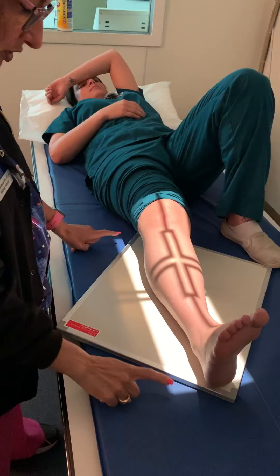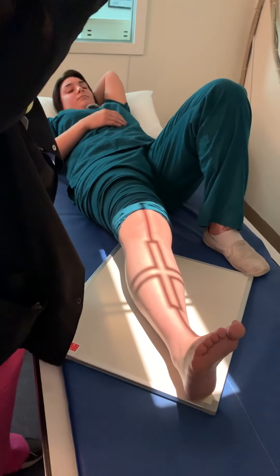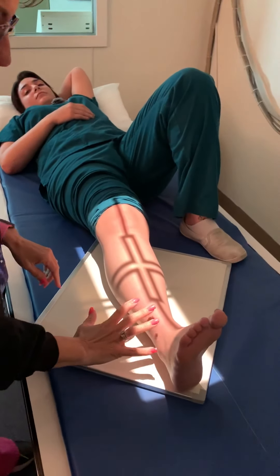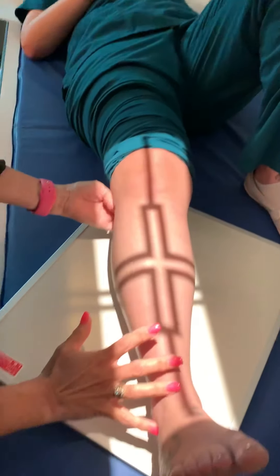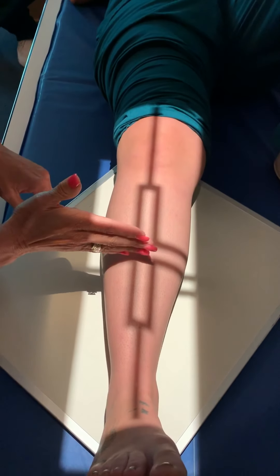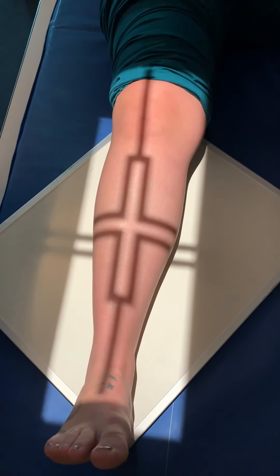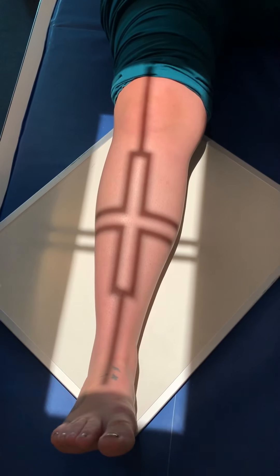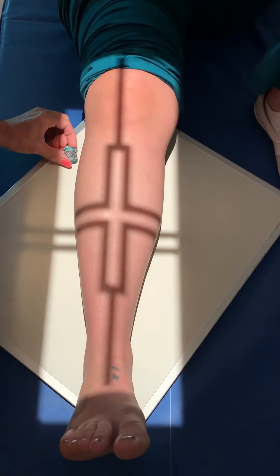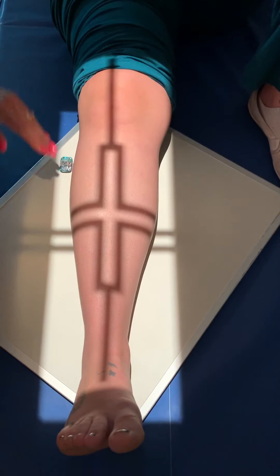When you're collimated that way, you're probably going to still have some light off of the IR — that's okay, there's not much you can do about it. Central ray is mid tib-fib. I put my fingers down by her malleoli and another finger by her knee and go in the middle, top to bottom, just including both sides of her leg. The marker goes lateral to the part — it doesn't really matter where exactly, whether up high or down low, as long as it's on the lateral aspect of the part.